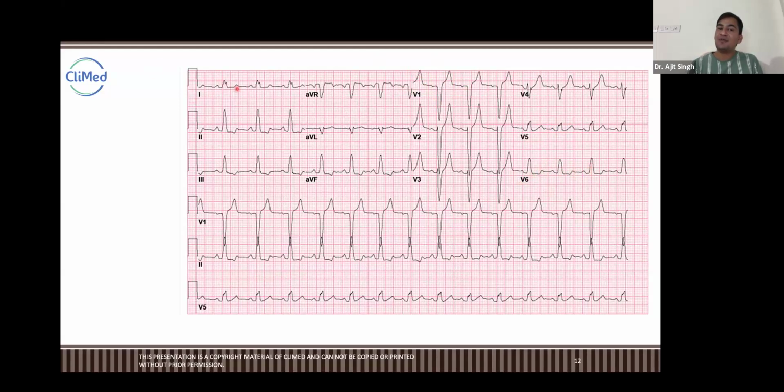And you can see M in lead 1 also, either lead 1 or V1, anywhere you check, this is a clear M. Initial waves, initial rhythm, it is M. And here it is W. It is clear W. There is no M at all. Who was telling this is M?